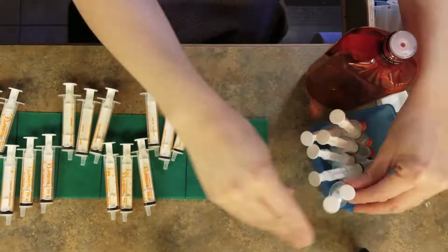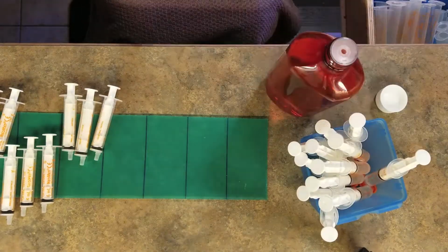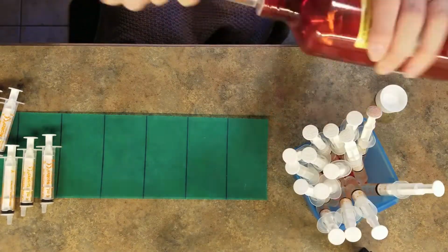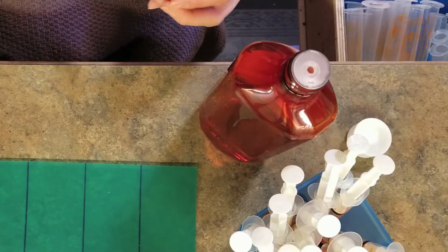And so it takes a bit of work, pulling all those syringes and putting caps on them and putting them into the appropriate bin. You want to be very meticulous and cautious about this. Don't do this when you're tired or can't think straight.